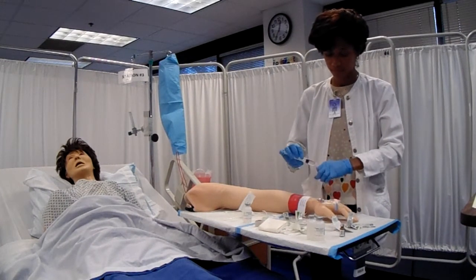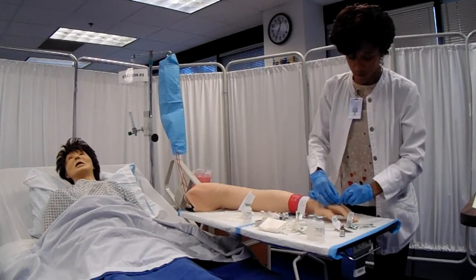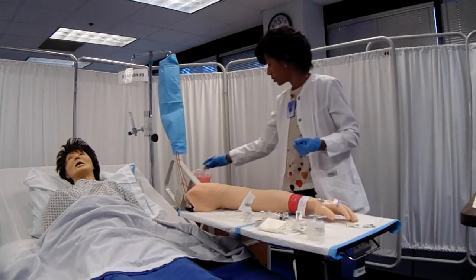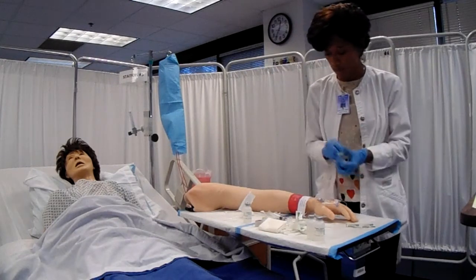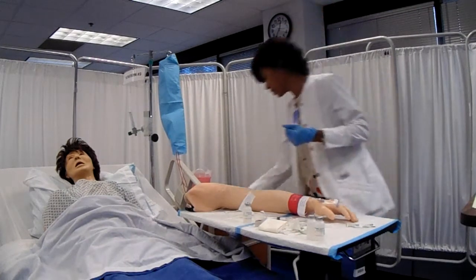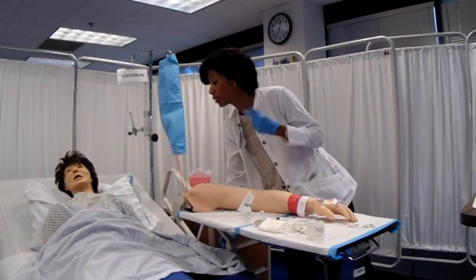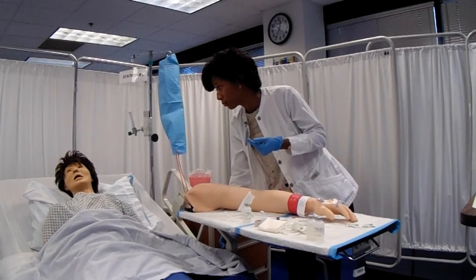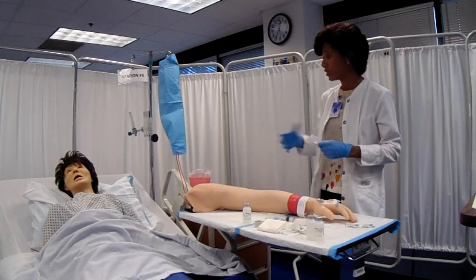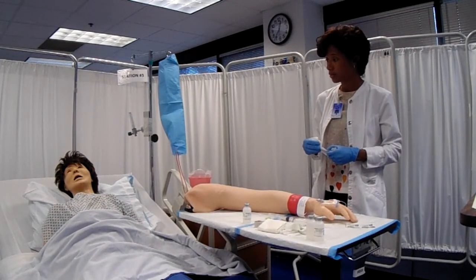Great. How are you feeling? Good? Okay. I'm going to go ahead and reclamp my tubing, dispose of my equipment and garbage, and reposition you to a safe position. I'm going to reinforce the instructions that call for me if you need to go to the bathroom. And let me know how you're feeling. I'll probably do another set of vitals when I come to check on you in 15 minutes. Do you have any questions? Great.